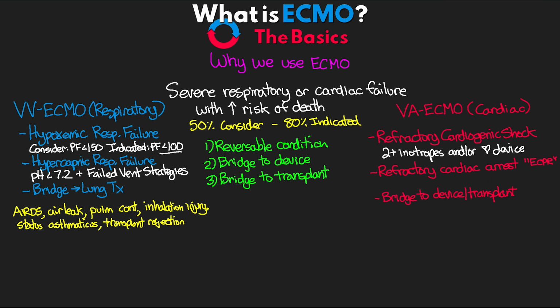In the case of our ECPR, here if we have no ROSC that has come about after 10 minutes, and we can get them cannulated in under 60 minutes. And then again, finally, the bridge to a device would be some sort of ventricular assist device, LVAD, BiVAD, total artificial heart, something like that, as well as a heart transplant.